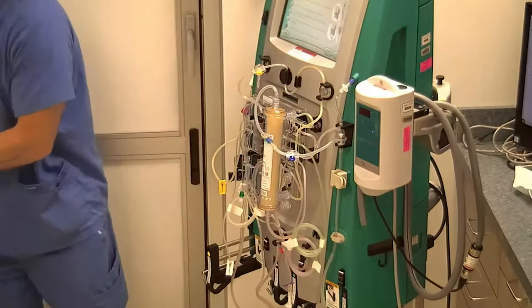So to make sure that we have the most efficient, clean process connecting to our patient, right now we're going to go ahead and disconnect our Y from the yellow, and this is typically our drain line, and we're going to connect it now to our waste bag and remove the blue line from the waste bag, placing the yellow on. You want to make sure when you're doing this, of course, you always want to have gloves on. I haven't had those on the whole process, but in real life, you do. Then you want to connect. You don't want to let any of these connectors hit anything while you're disconnecting and connecting.